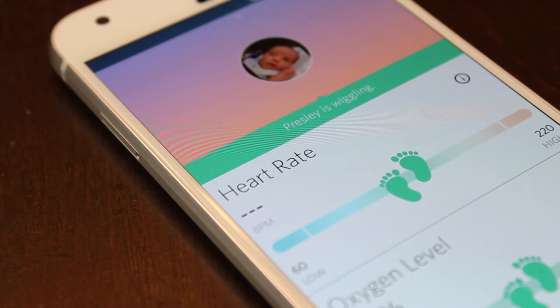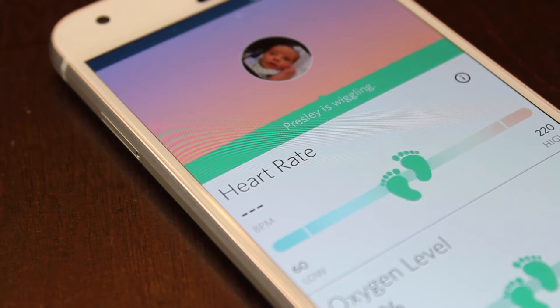The Owlet app is available on both Android and iOS, and not only will you get notifications sent to your phone, but you can also log in at any time and view your baby's heart rate and oxygen levels.